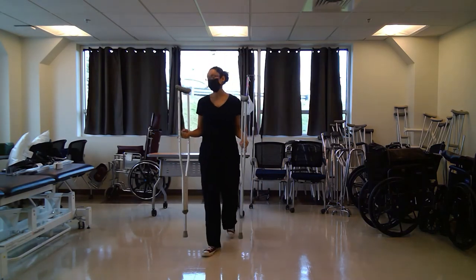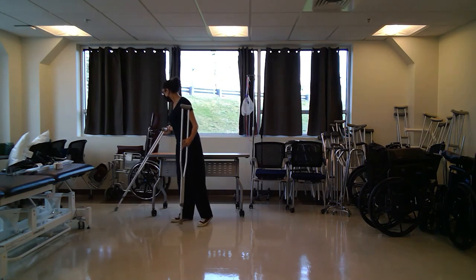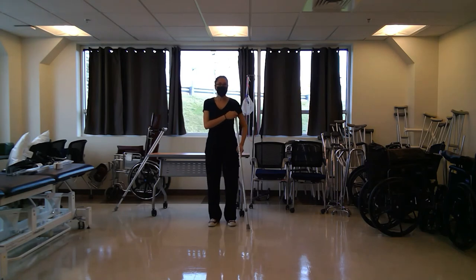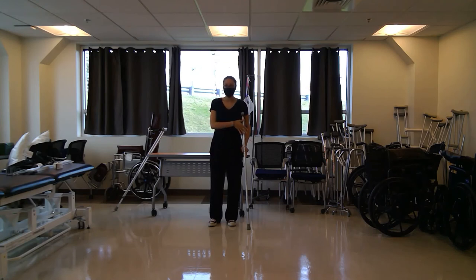The four-point modified uses one assistive device — again, you can use a lofstrand crutch or a cane — and it goes on the opposite side of your affected leg. So if my right side is my affected side, I'm going to put the crutch on my left side.